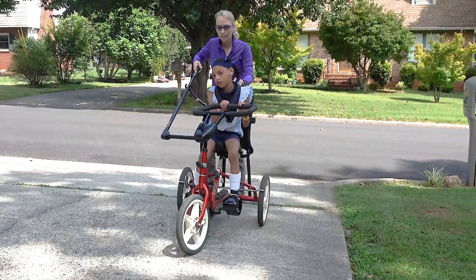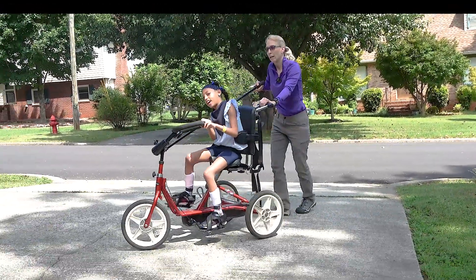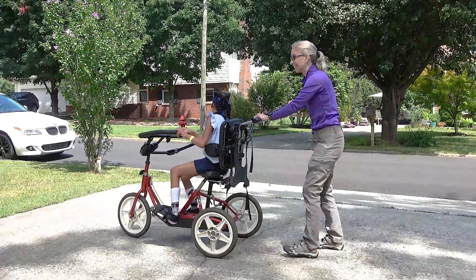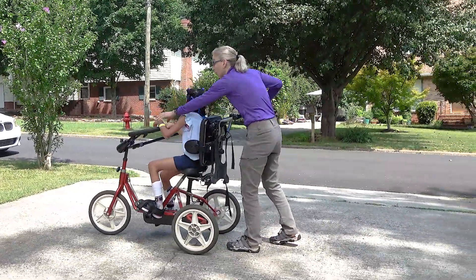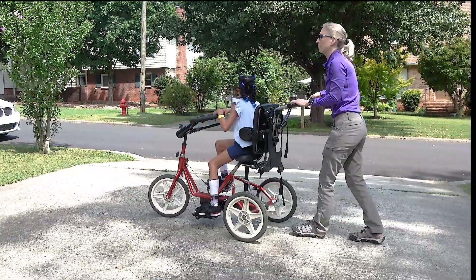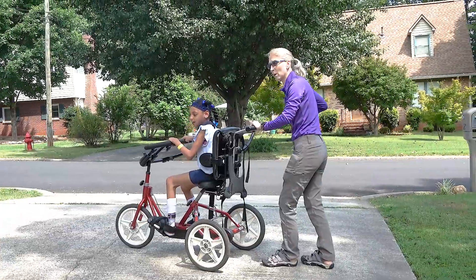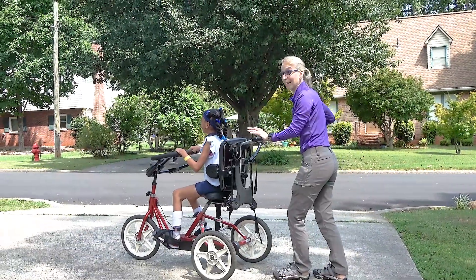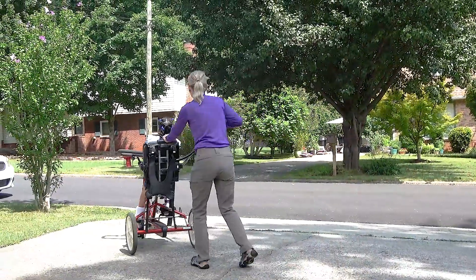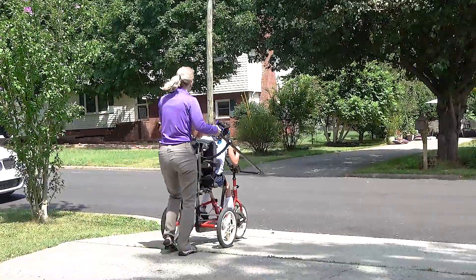You got both hands on. You ready? Let's give a good clear look of everybody. So even for children who cannot push with their legs, I still like this tricycle. Hold on with two hands. Because it helps — it's like a fun way to do range of motion, but for Alexis, she can definitely active assist. Alexis, you need to be holding on with two hands. Which way do you want to go?